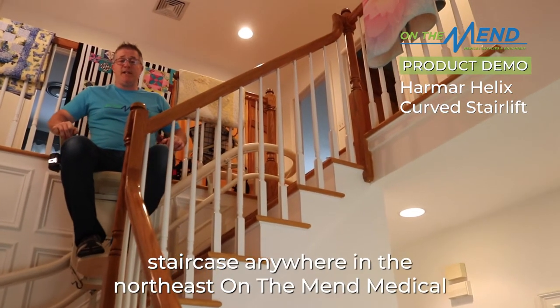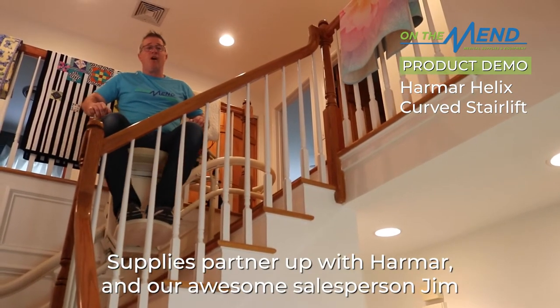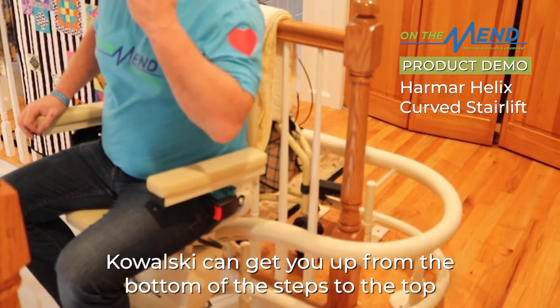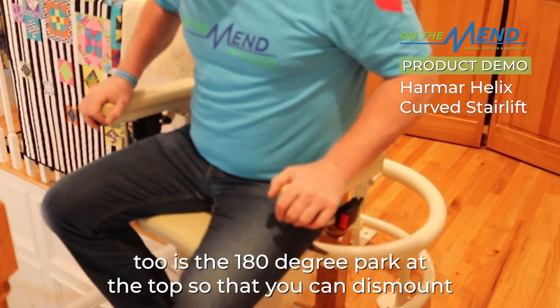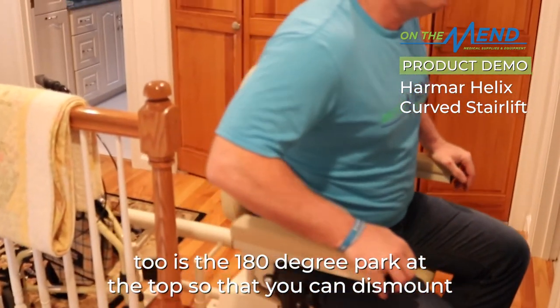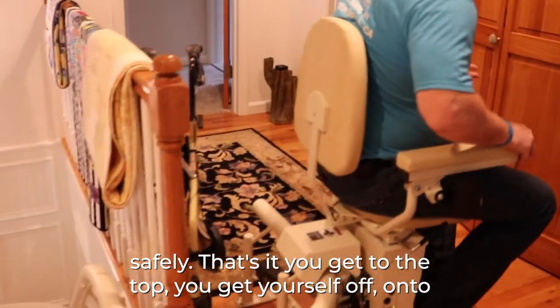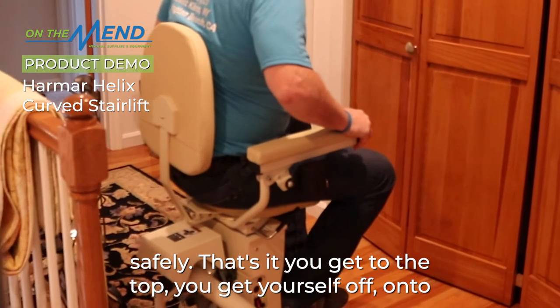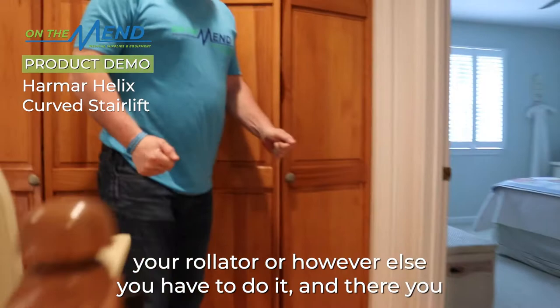For any staircase anywhere in the Northeast, Northeast Medical Supplies has partnered up with Harmar, and our awesome salesperson Jim Kowalski can get you from the bottom of the steps to the top of the steps in any kind of situation. The best part is the 180-degree section at the top so that you can dismount safely.